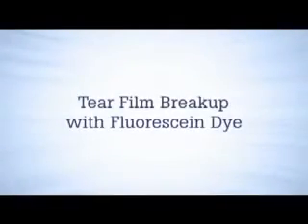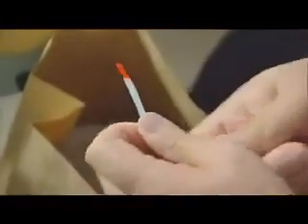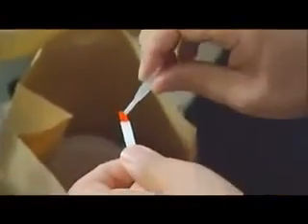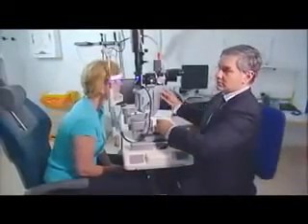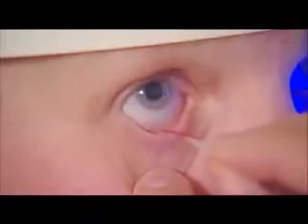The tear film breakup test and grading staining at the ocular surface with fluorescein dye. The patient is seated comfortably at the slit lamp, looking straight ahead and blinking normally. An impregnated fluorescein strip is prepared, opening the envelope away from the impregnated tip and moistening the tip with a single drop of sterile saline. As soon as the tip is fully wetted, the excess is shaken off briskly, and the drop is delivered quickly and lightly to the back of first the right and then the left lower tarsal plate.